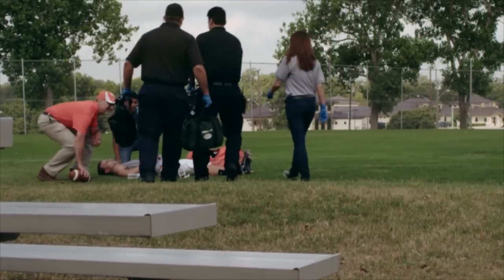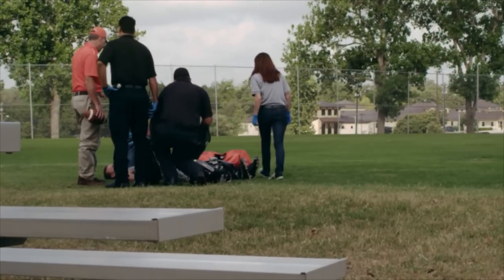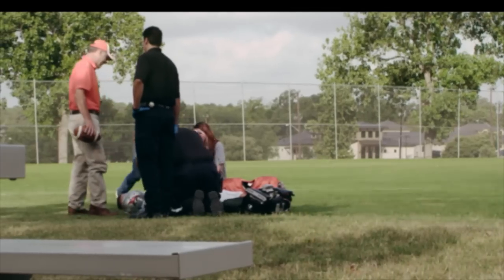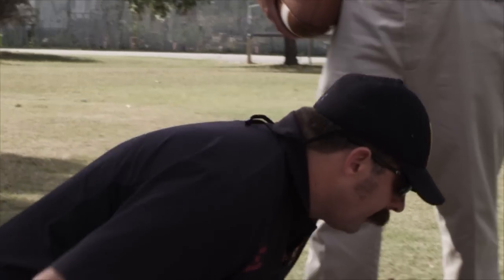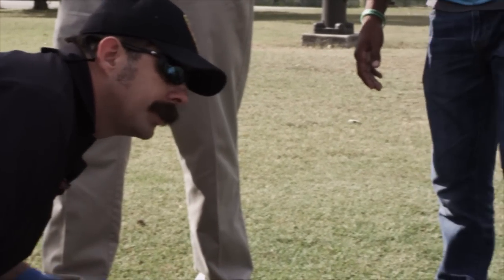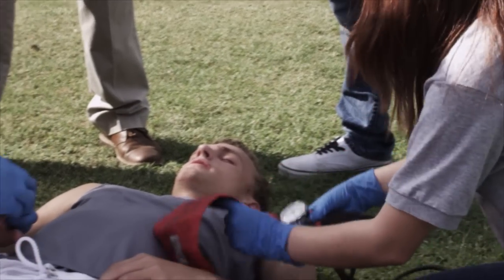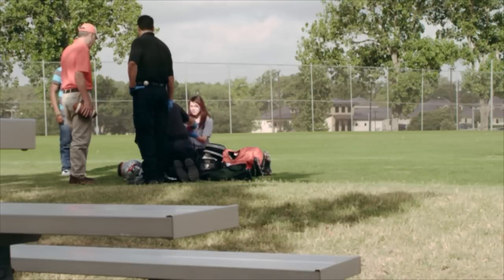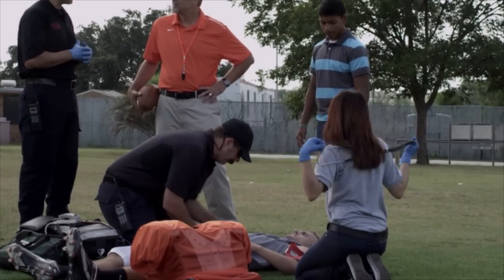All right, Coach, what do we have, sir? We were finishing up some up-downs, and he was acting okay, and then he kind of just passed out. He'd been drinking water and everything, but... Okay, Coach, do you know if he takes any medicine for anything daily? No, I don't know. Do you know if he has any cardiac issues, diabetic issues, anything like that? No, he's in good health otherwise. Okay. Don't know what happened. My partners are going to assess him real quick, and then we'll be able to determine what's going on.